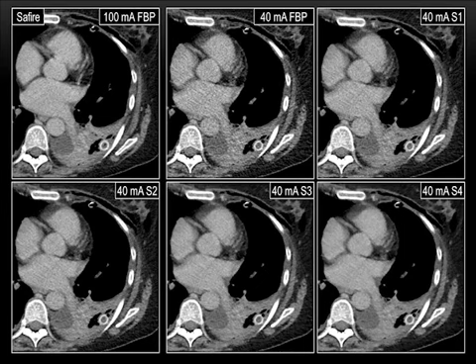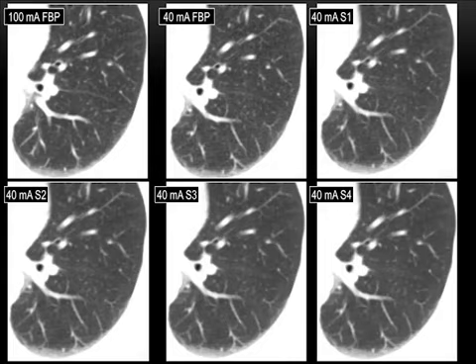And when we do any sort of subjective analysis, when you show these images to a radiologist, I think the most important thing is they want to see that, okay, noise has gone down in the mediastinum in all these structures of the heart, but they want to see the edges as sharp and crisp as this one. Only then can they call these two images comparable. So the message here is IR does reduce noise, but be careful to look at the visibility of tiny structures and the edges. And let's look at an example of a chest CT.